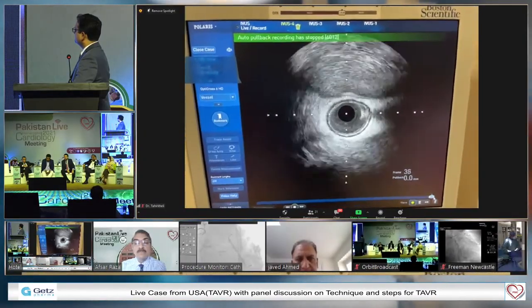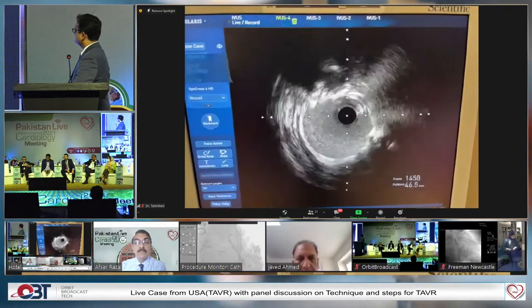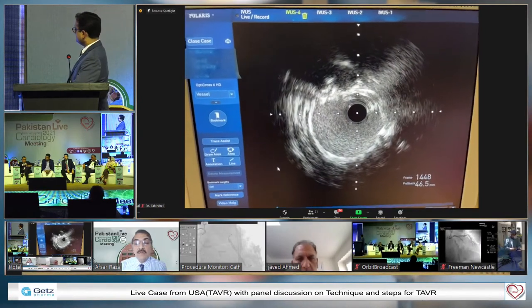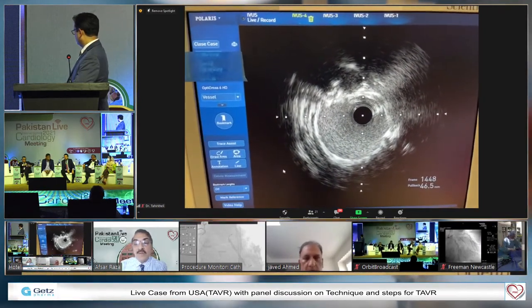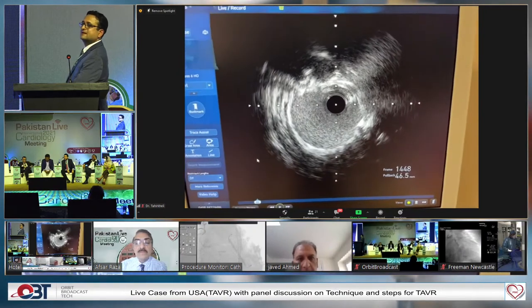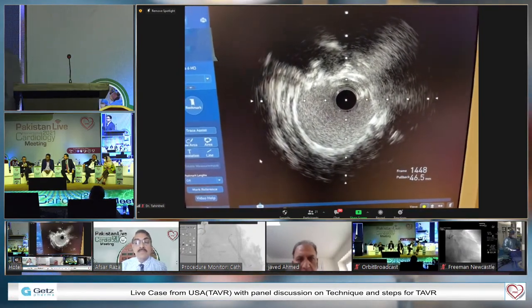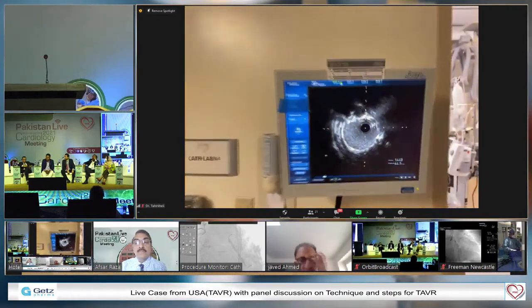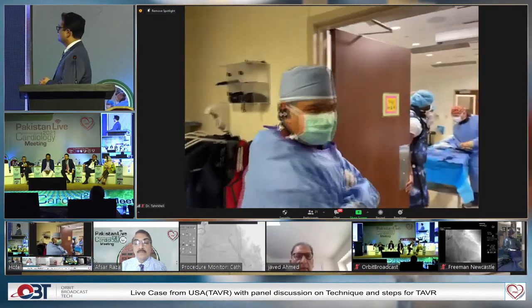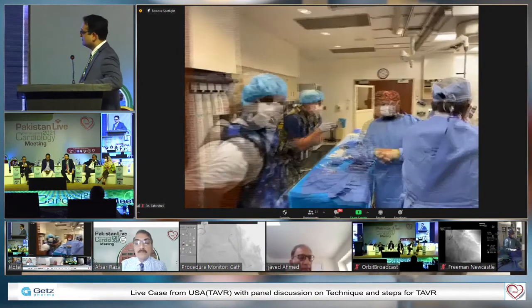What stent did we put in? Resolute Medtronic. Naeem, can you hear us, please? This was a 3.5 by 12, and they put in a 4.0 non-compliant balloon after. I think this is a very good expansion of your stent, Tahir. Thank you. Well, while I was doing TAVR, these guys got done. I just helped them to get the Impella in, which was getting a little difficult. But we got great interventional cardiologists here.